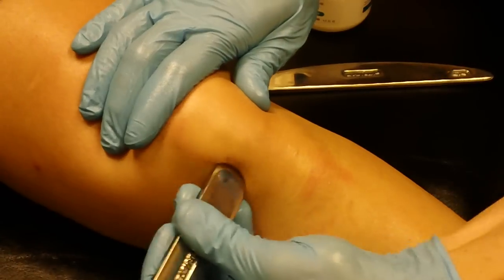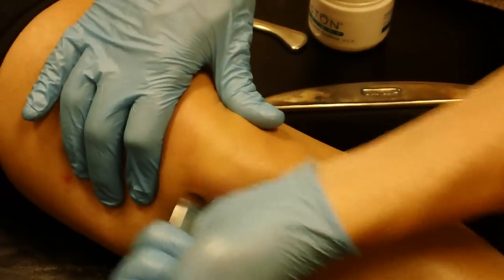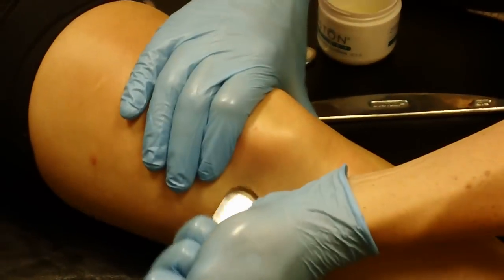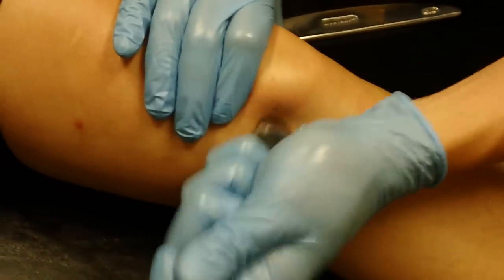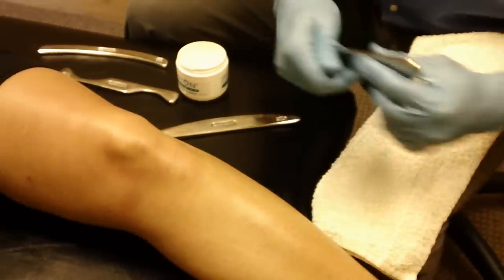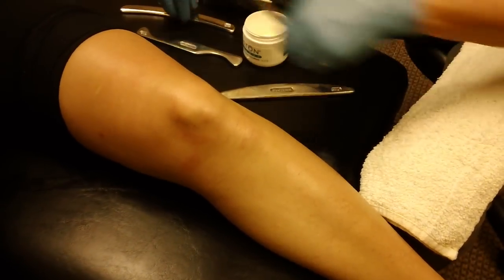Around the kneecap itself, if we've got some chondromalacia problems in there, we can displace that kneecap and work right underneath it — that's very, very effective, but also very tender. If we wanted to work actually into the groove of the meniscus, we can get in there and work in a very focused way. This instrument is also very effective in working around scars — so post-surgically, to release the adhesions around a scar, this one is very appropriate.